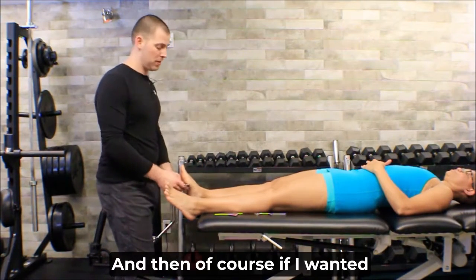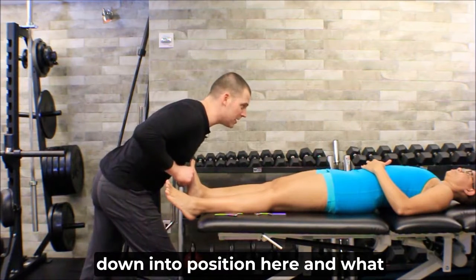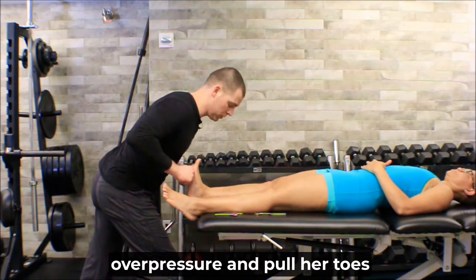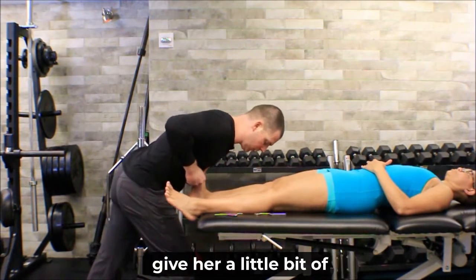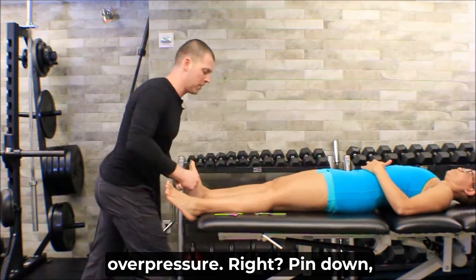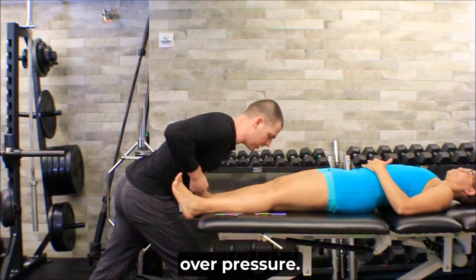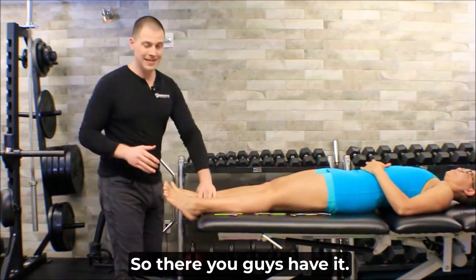And then of course, if I wanted to be really tough, I could get down into position here. And what I'm going to do is use my chest to help add some overpressure and pull her toes back. So I'm going to pin down, have her pull up, and then just give her a little bit of overpressure, right? Pin down, have her pull up, give a little bit of overpressure. Right? So there you guys have it.